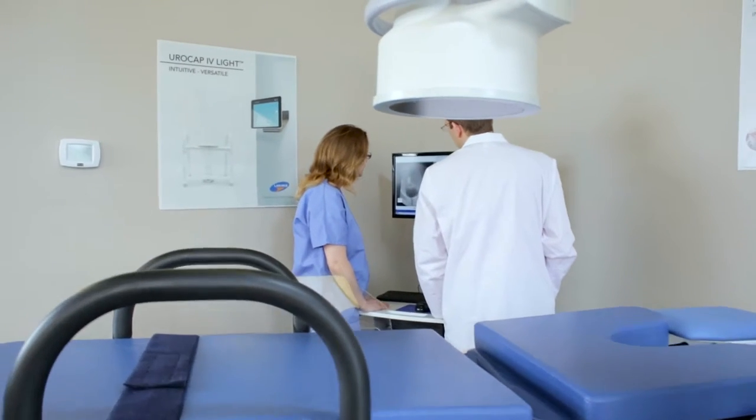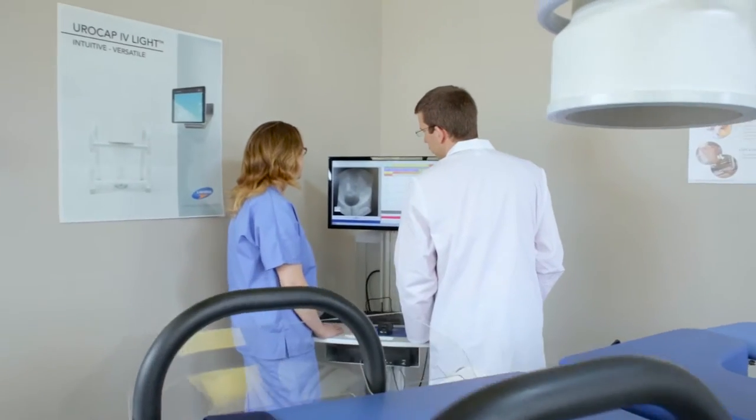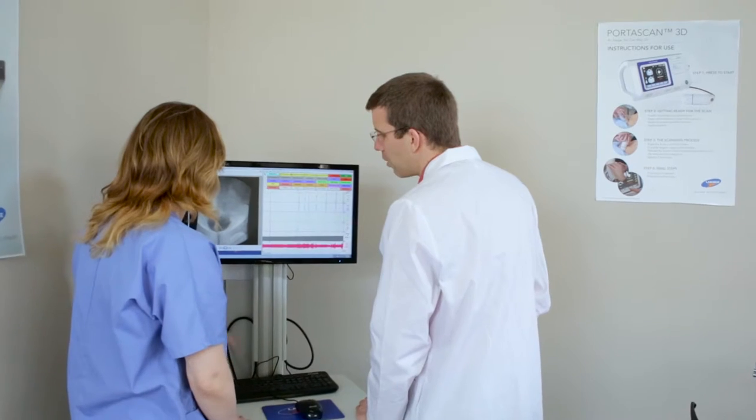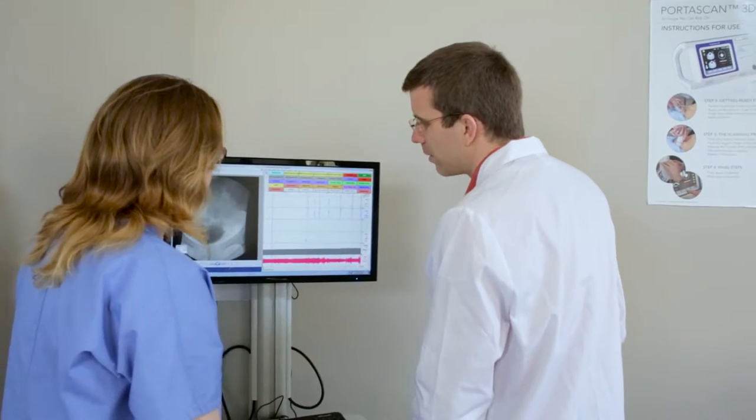The 6210 Video Fluoroscopy Table is designed for standard and video urodynamics examinations along with general urology and gynecology procedures.